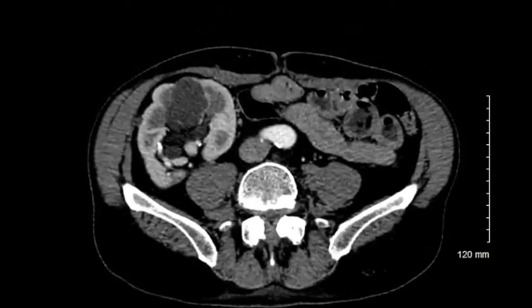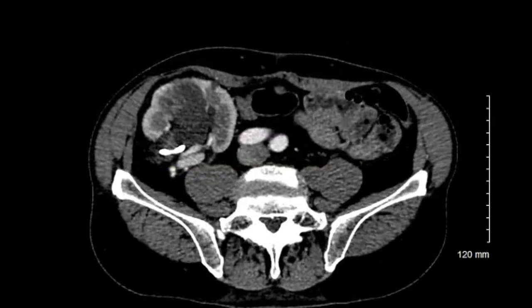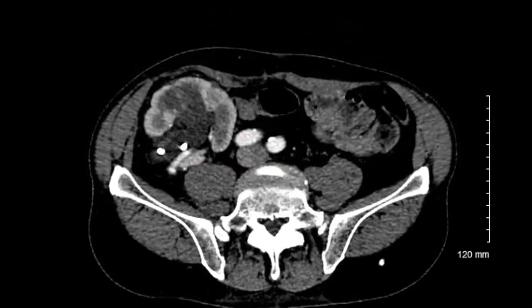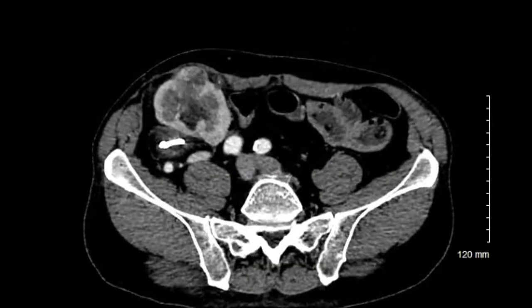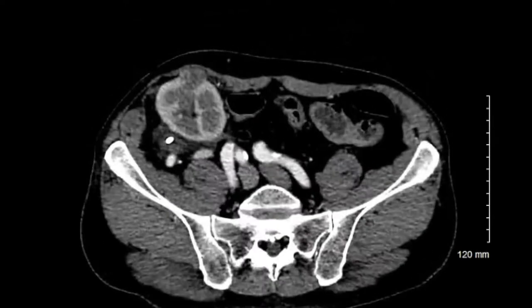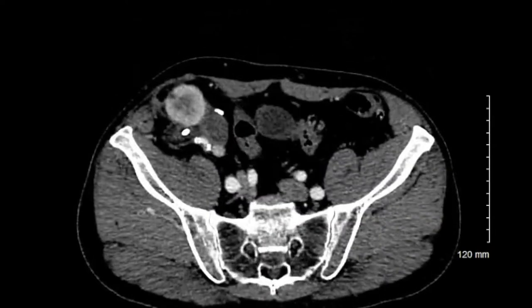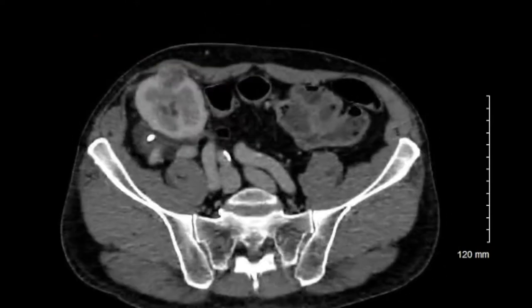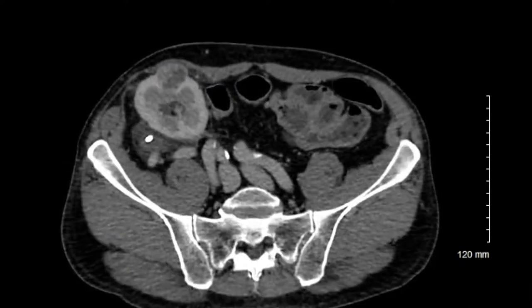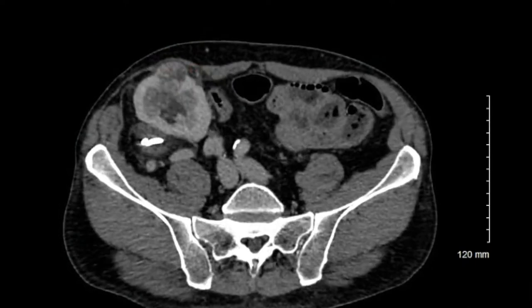This is the case of a 69-year-old patient, transplanted in 2012 with diabetic nephropathy. During follow-up, a 2.5 cm lesion was discovered and later confirmed on CT scan.